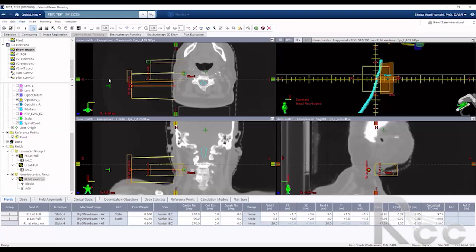All right. And so if you want to do an isodose distribution of photons and electrons together using CT-based planning, you have to match the photon and electron on the screen just like you do in real life. So with the field lights, right? And as I said, I made several copies.